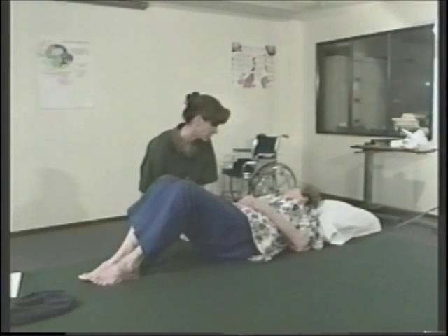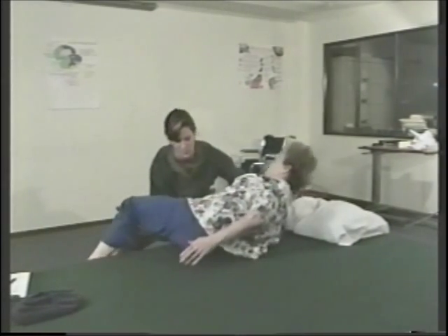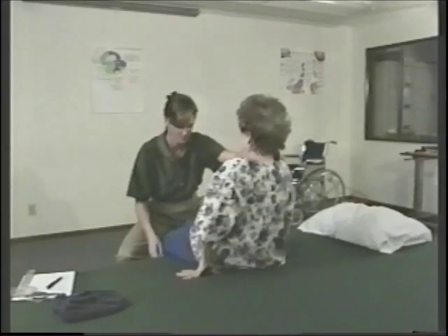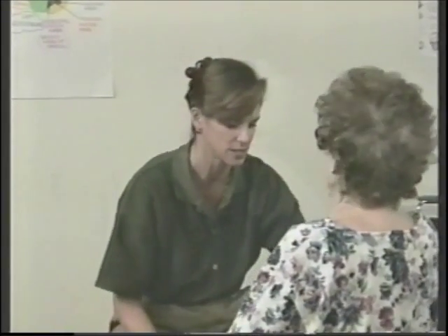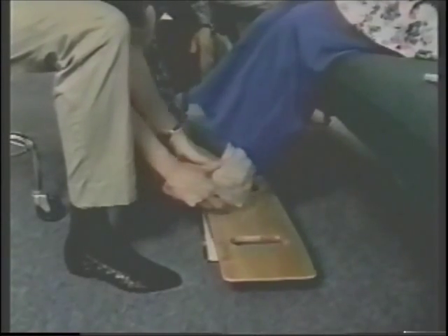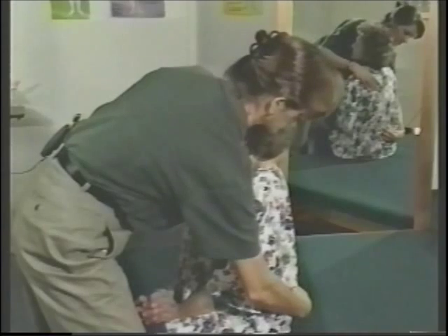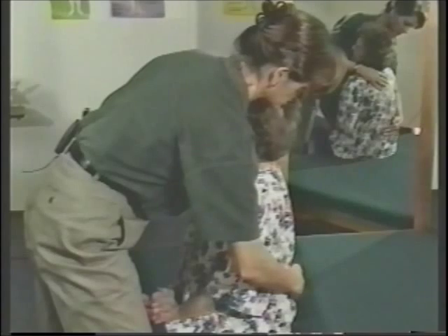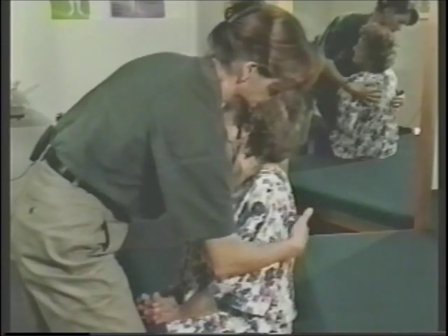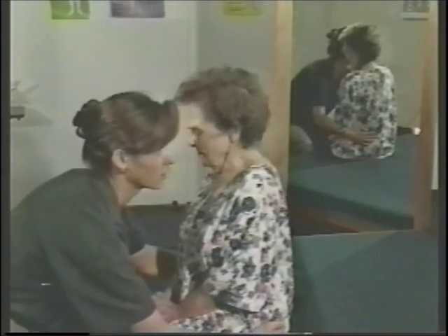The next part of the evaluation — I'm going to have you sit up on the mat. I'll help you roll towards me and let your feet off the side. Bob, if you could bring the mirror over so I can see what's going on with her trunk. We also need a little more support for her feet because her feet cannot reach the ground — about four to five inches. Looking at her spine to see the curve and to inspect the spinous processes for any projections that might cause pressure and possible skin breakdown. Her shoulders are the correct height and her back looks to be very straight.